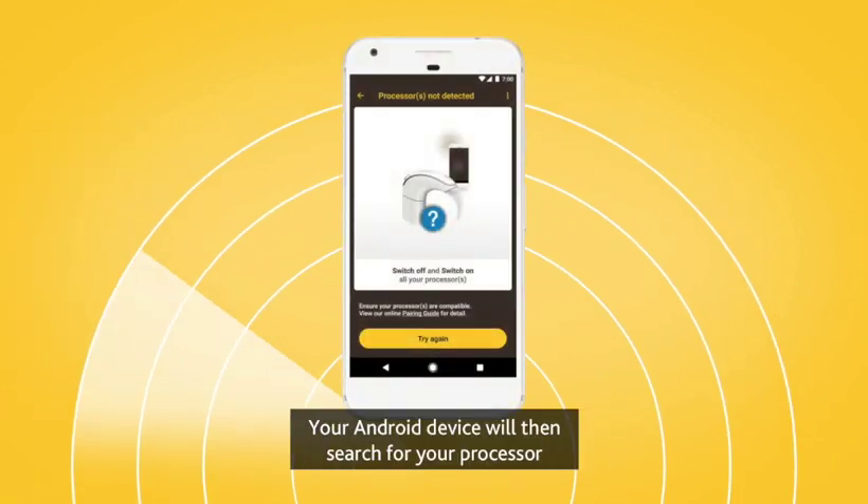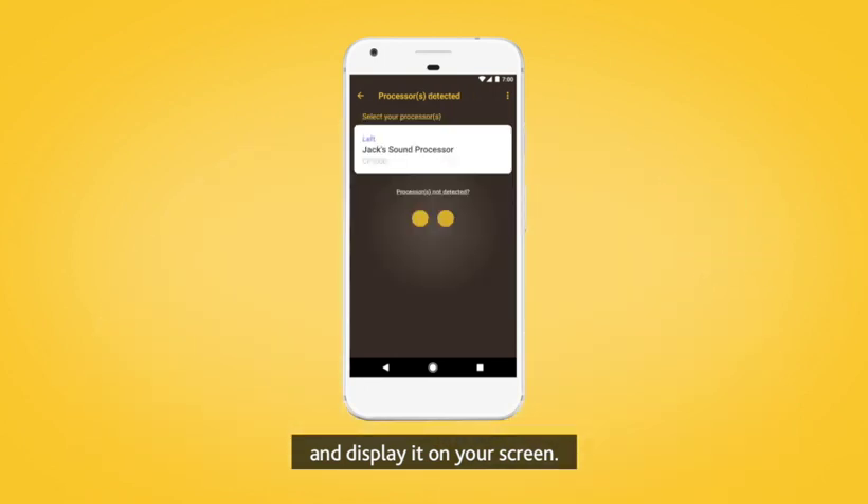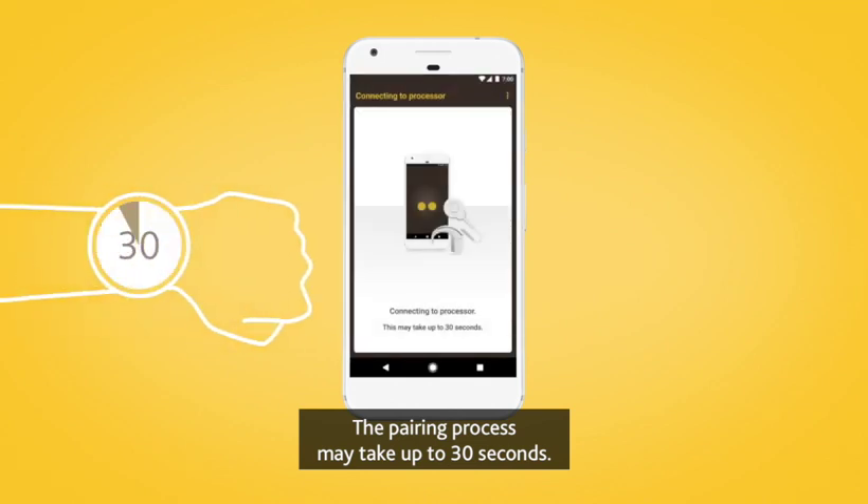Your Android device will then search for your processor and display it on your screen. When your sound processor displays, tap once to begin pairing. The pairing process may take up to 30 seconds.